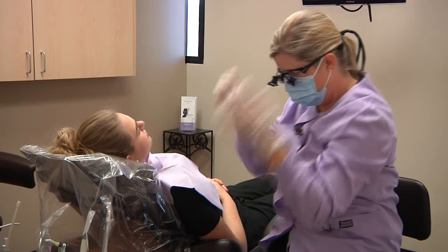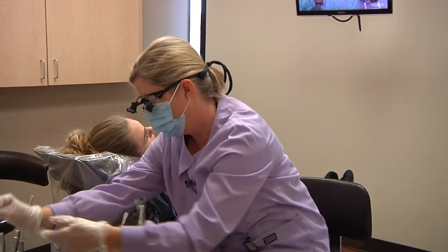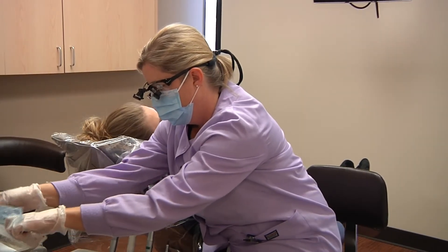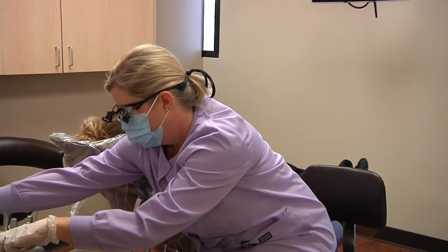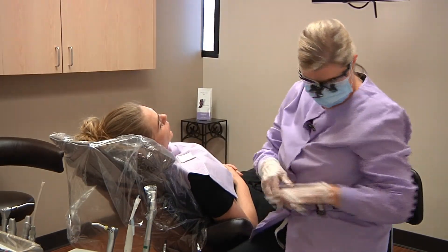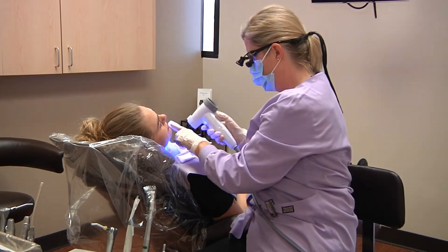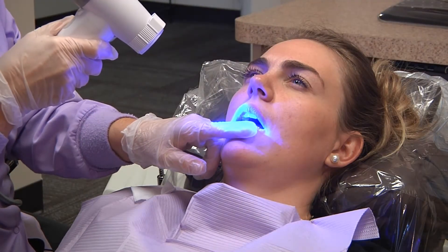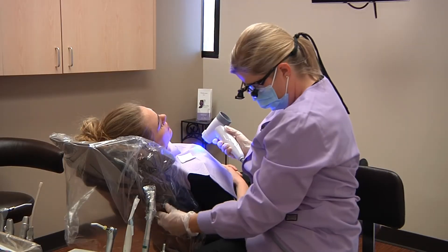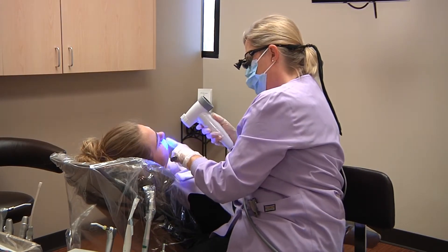April, as I'm doing your exam you're going to be feeling some warmth from the light, and I'll have you stick your tongue out at me and so forth, and we'll guide you as we go along. So first I'm going to be looking at the outside of your lips. This will show me if you have a lot of sun damage that's already beginning, and then we can make sure you're wearing your sunscreen on your lips.